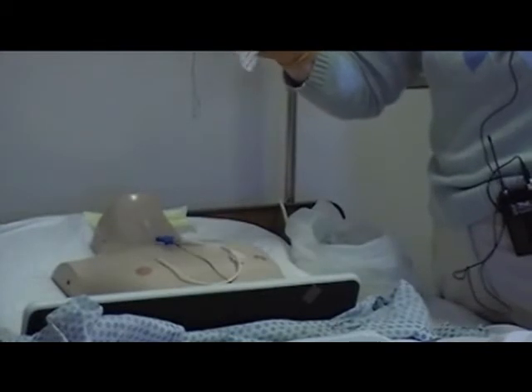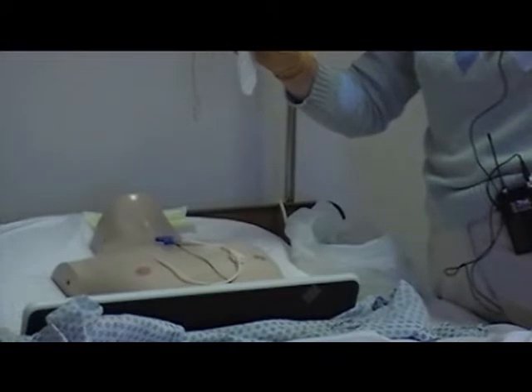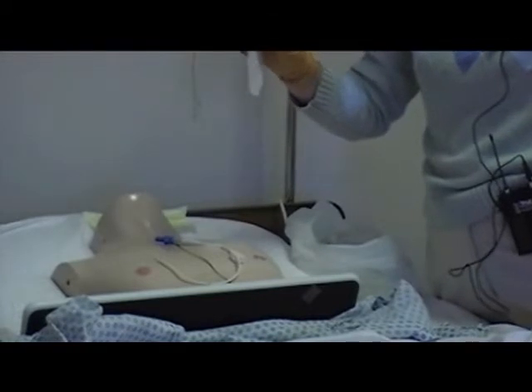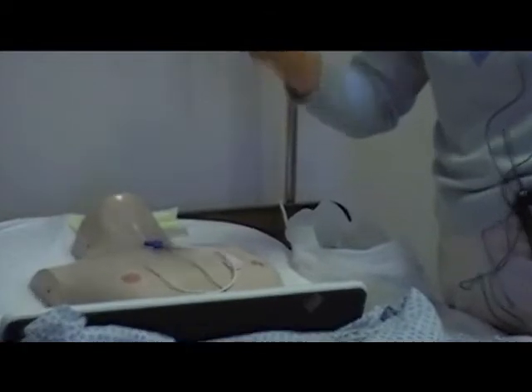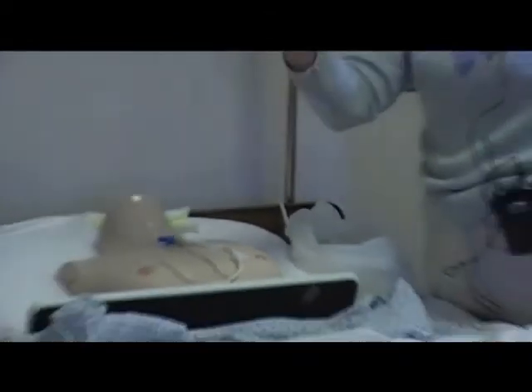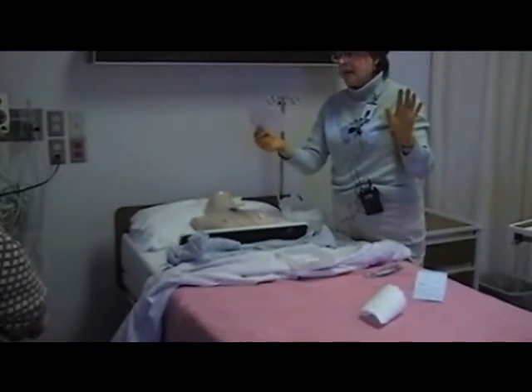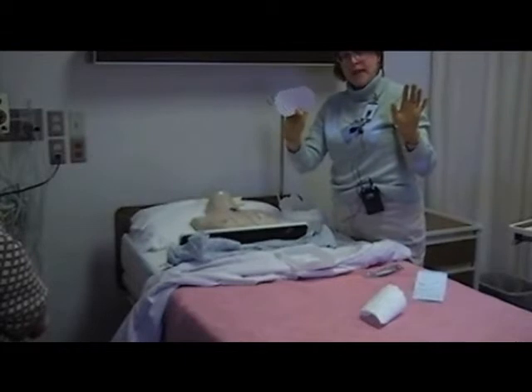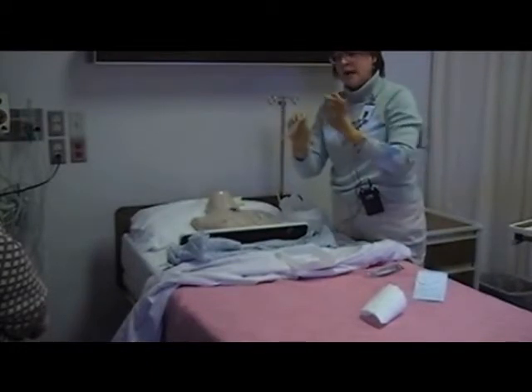Okay. Now I do have my one hand, which I did touch, that is no longer sterile. So I don't want to touch any of the sterile part with my non-sterile hand. This hand is sterile, so I can touch any part of this. The Opsite that is prepared in your package has a back panel that is going to come off first. And I believe you've dealt with some like this before. Okay. So you'll peel off that back panel.